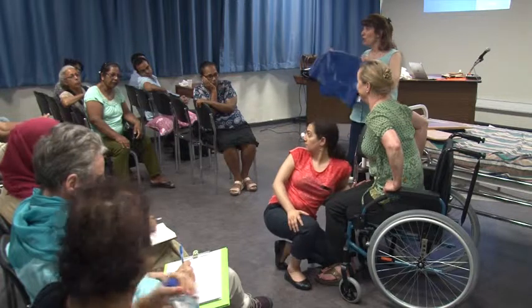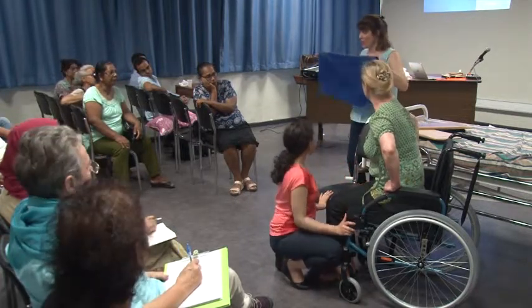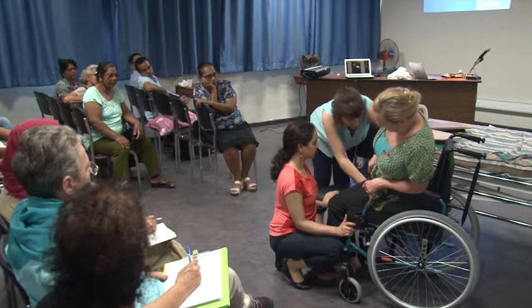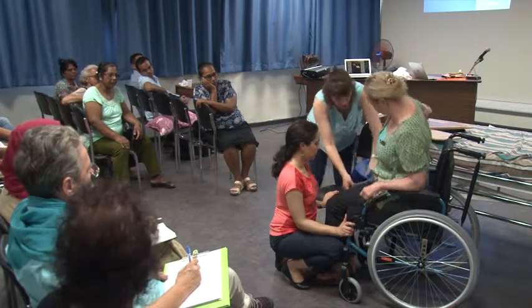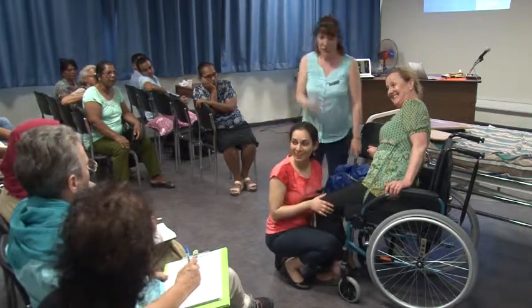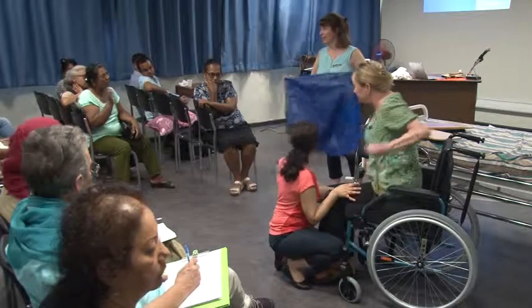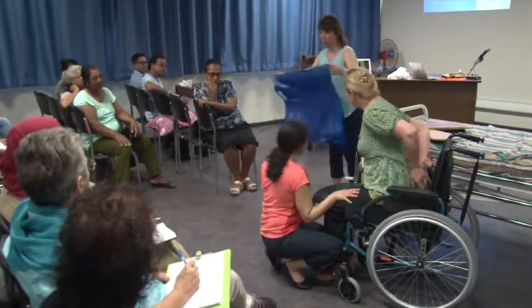Feet on the floor. You can always, if you've got someone that's really big and they can't do that, slide this underneath them and use this. So just tip to the side for a second. So you get them to lean a little bit. If they can't move at all, just tuck it under, sit back, and just use this. And that can happen. Okay? So there we go. And yes, absolutely. Putting it on. We'll just show you that later.